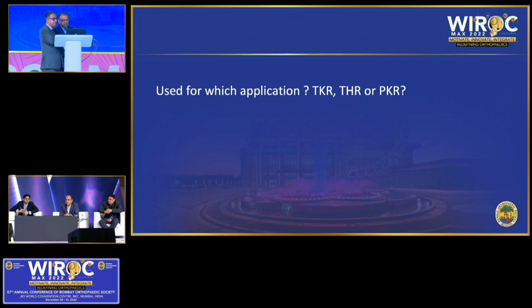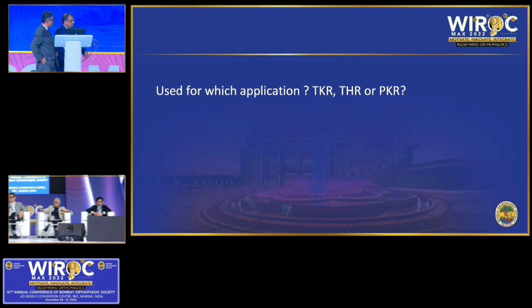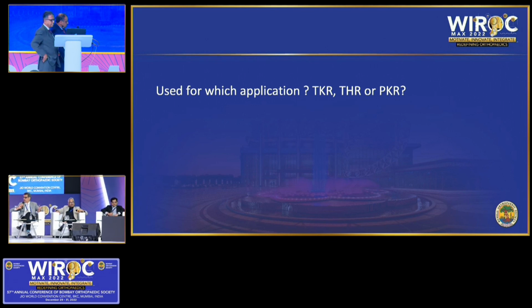So that's quite fine. Mahesh, what applications, what surgeries do you trust with the robot? All of them actually. I'm using it very, very routinely for hips, knees. Partial knee replacement numbers are a little bit less in my practice, but I'm sure that it is the best indication to use a robot. But I heard that you did a patellofemoral replacement as well. Yes, I have done. I had completely forgotten. But excellent result, and it's child's play to do a PFJ replacement. It's absolutely child's play.